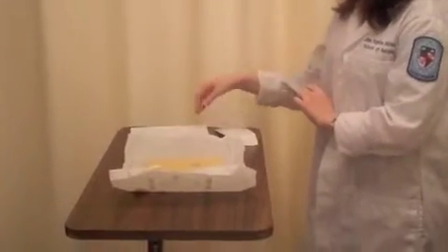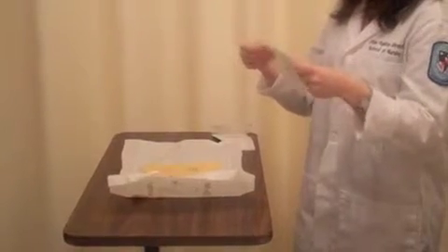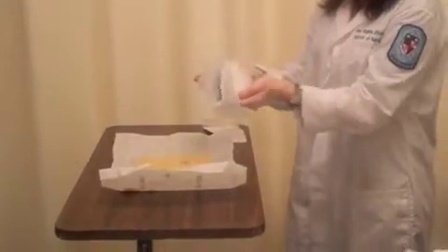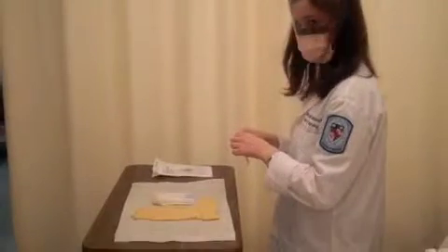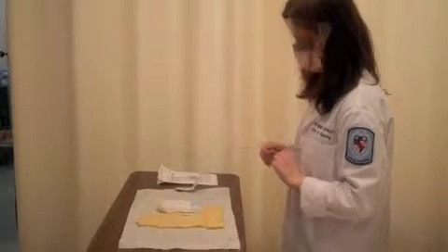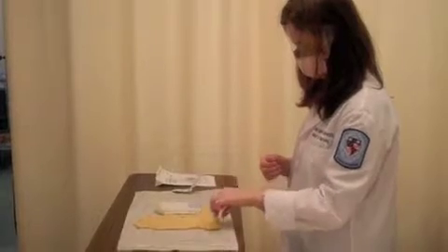Open transparent or gauze dressing and drop into sterile field. Open skin prep and place on outer edge of sterile field. It is now time to put on the sterile gloves.